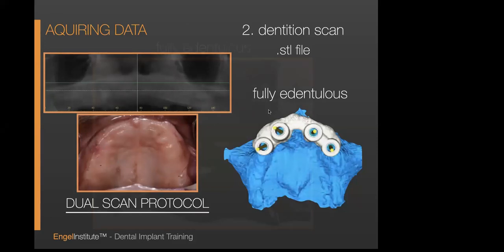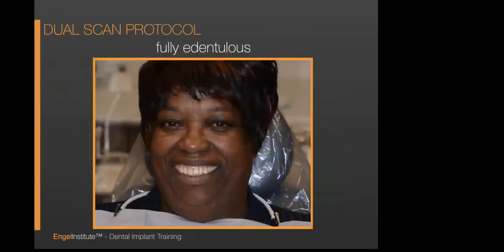Well, let's show you. Patient comes in, patient has a denture. The denture is okay, right? It's not bad. We definitely want to maybe make it more aesthetic, maybe change the positions of the teeth, change the midline. Number 11 looks like it's sticking out a little bit. Maybe give her a more feminine look, right? Not have the teeth touching the lip as they are. Yes, we can do that. But here's the point of this. For all intents and purposes, the denture's okay.